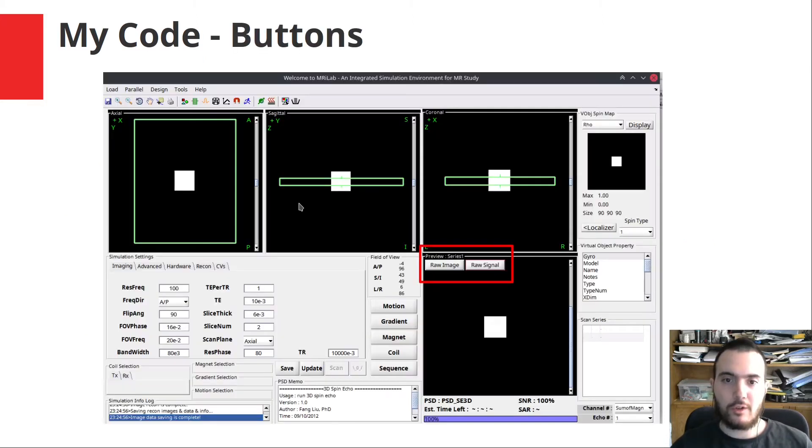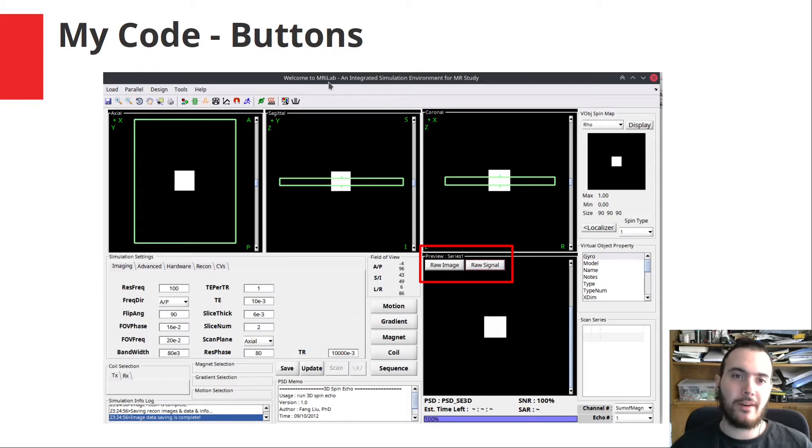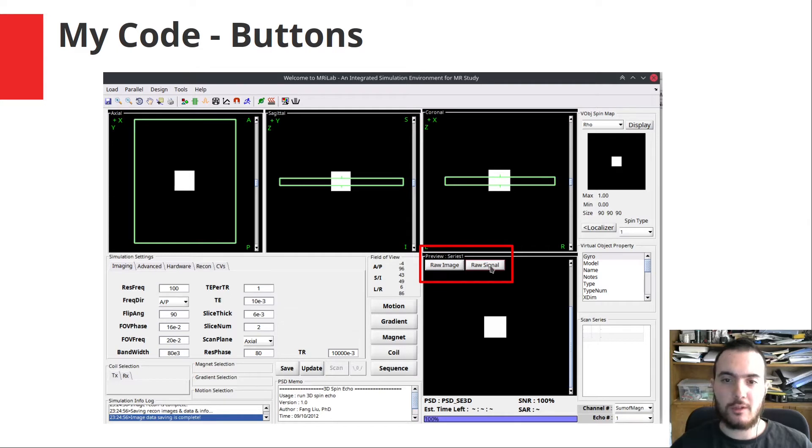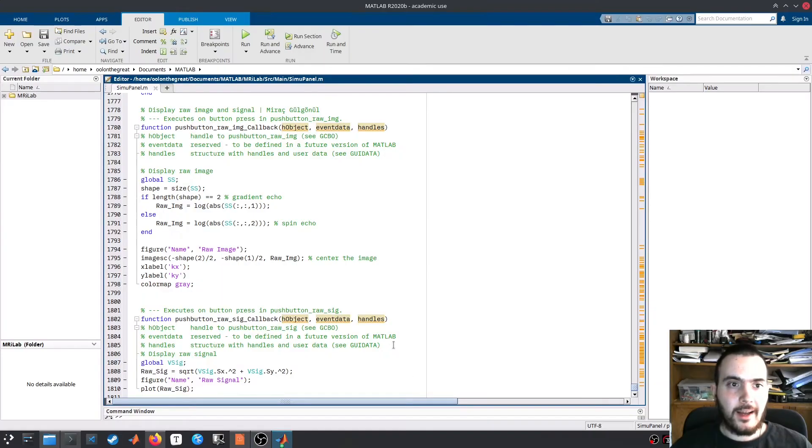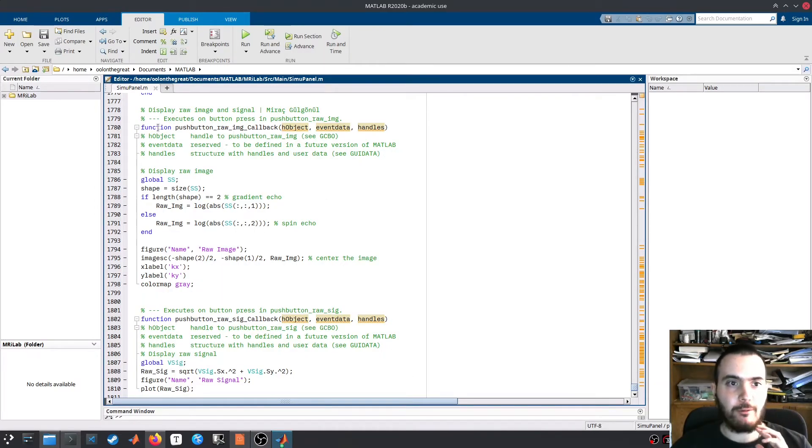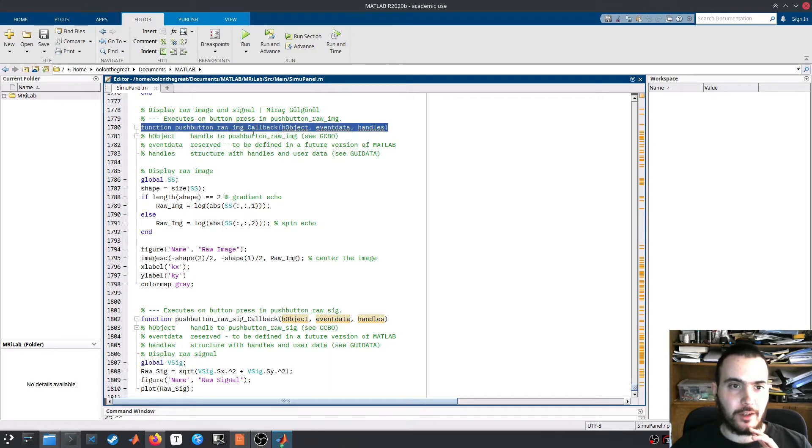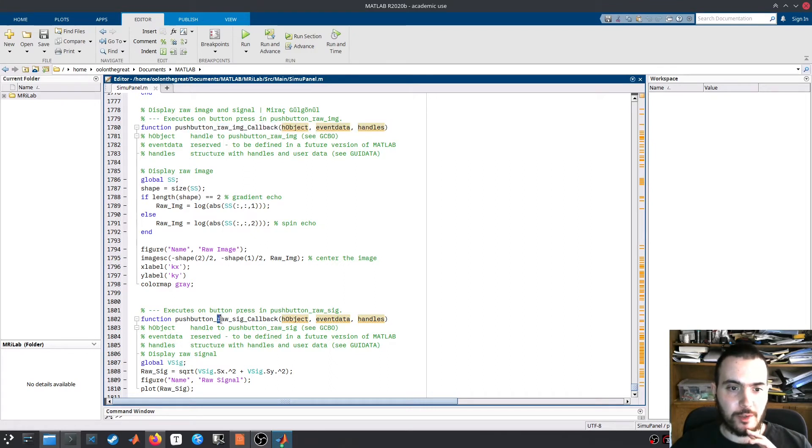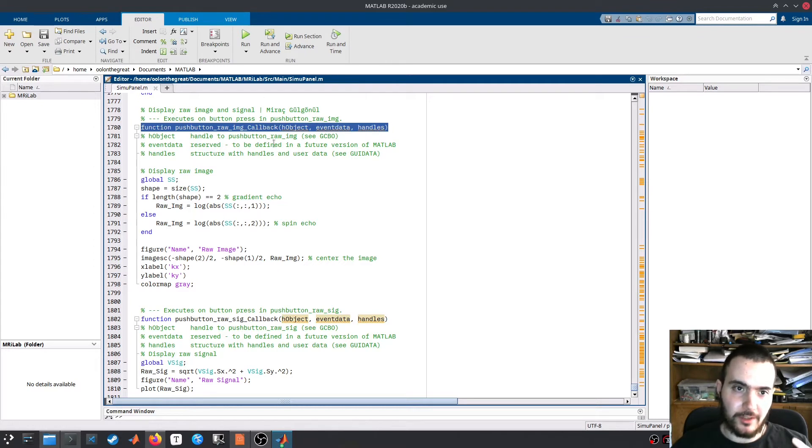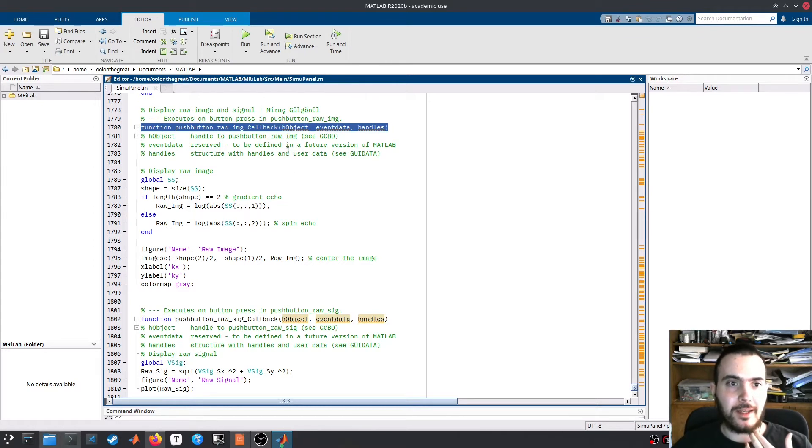To implement these in the existing MRI lab software, I coded two buttons for raw image and raw signal view. When you click on them, you see the raw image and the raw signal respectively. Here is the code I added in more detail. We basically have two functions for the raw image button and the raw signal button. These are callbacks which are executed whenever the button is pressed in MATLAB's GUI design.